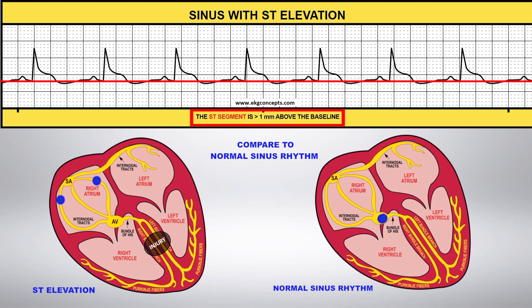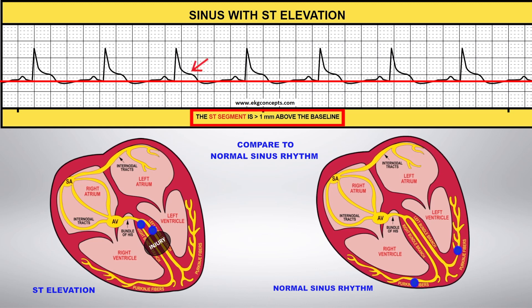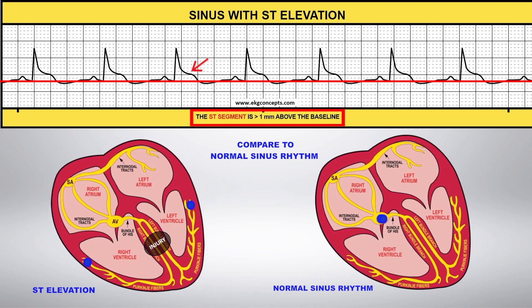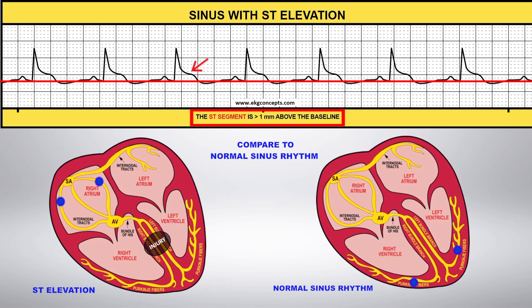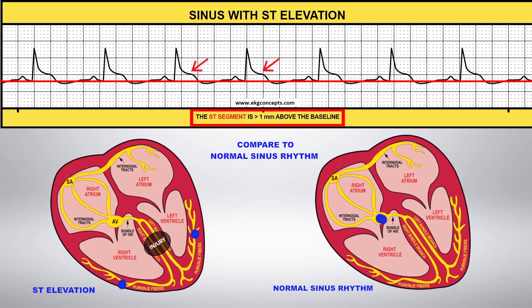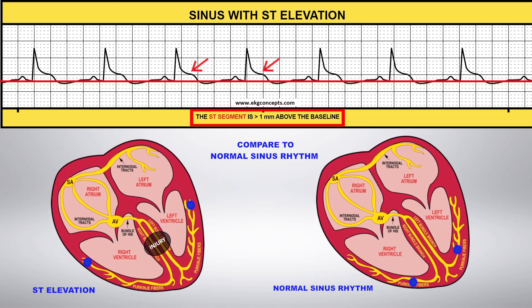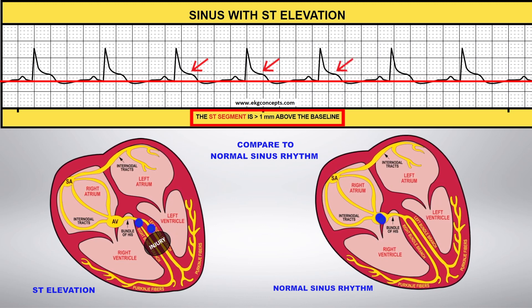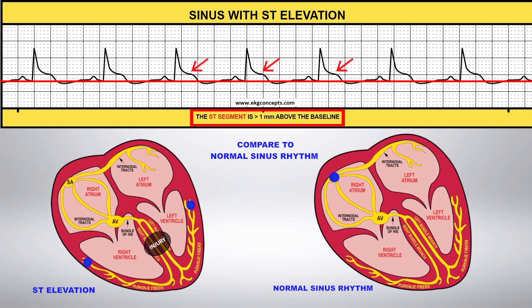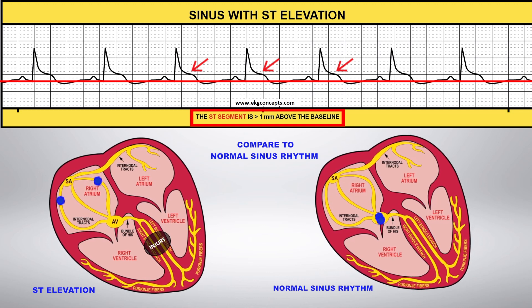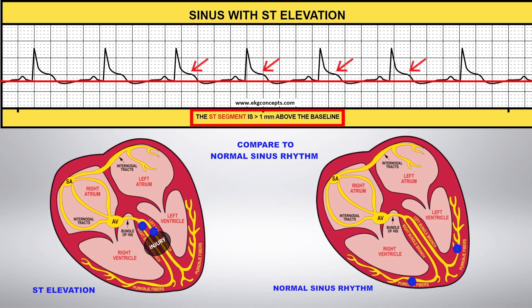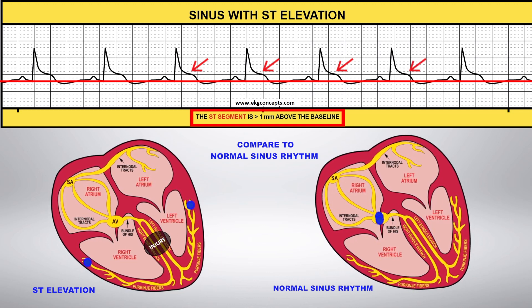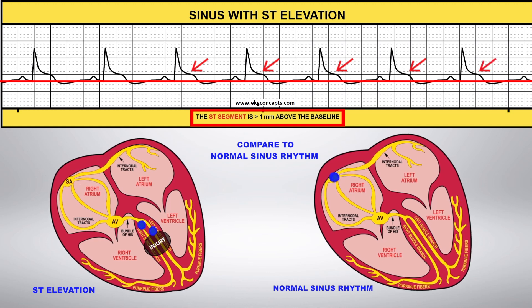When compared to normal sinus rhythm, you can see the ventricles are now having trouble depolarizing, represented by the impulse having to go around the damaged tissue during ventricular depolarization. ST elevation myocardial infarction is the most severe manifestation of coronary artery disease.